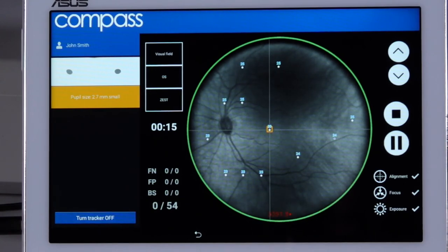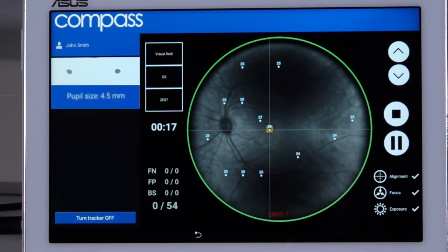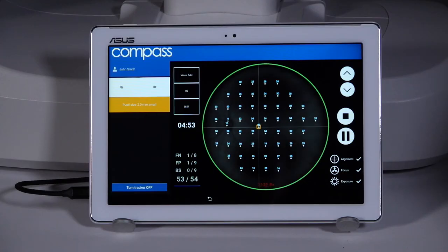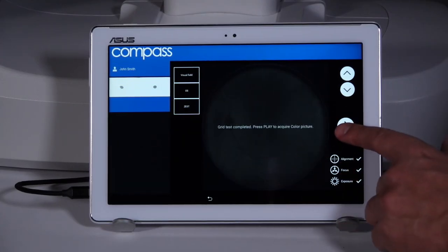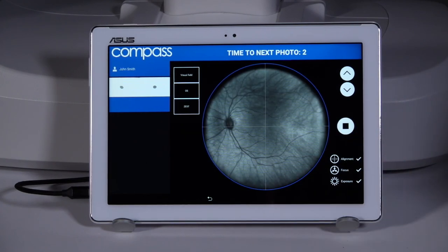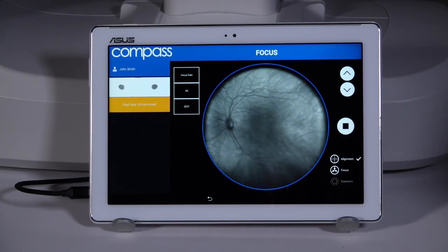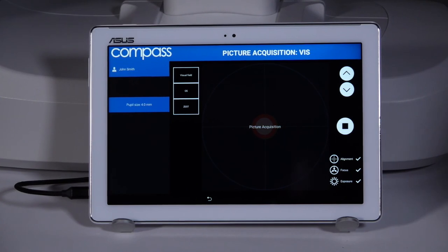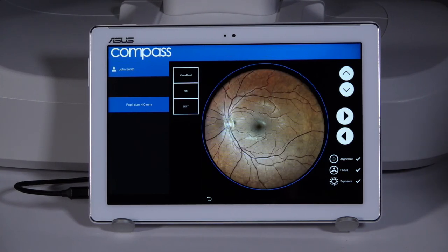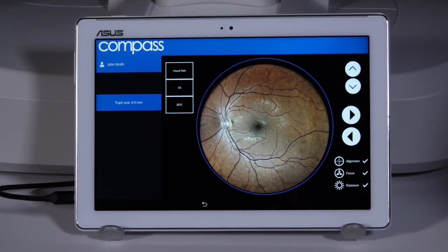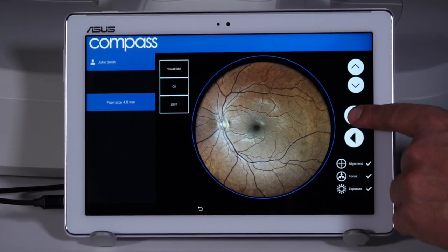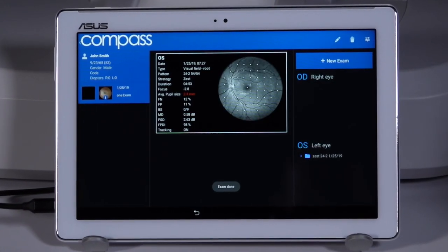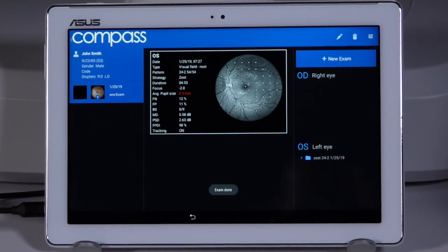Patient pupil size should be 3 millimeters or greater for best results. Upon completion of the exam, the operator will be prompted to capture a color image of the patient's retina. If necessary, press the Back button to retake the color image. Once the color image is captured, this will complete the exam for the selected eye and the results will be automatically saved.